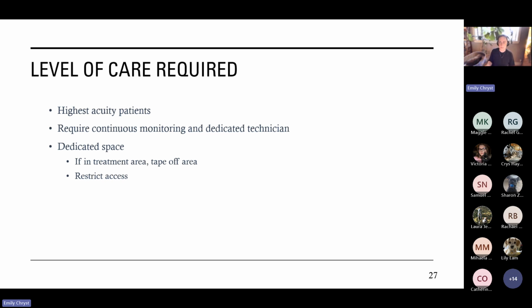The big difference is the stakes. So these patients are completely dependent on us for ventilation. That's why it's colloquially termed life support. So small changes matter more and big changes happen faster. So instead of thinking this is something totally different and this is terrifying, think this is what I already know, just applied more consistently and more vigilantly. So you're going to be watching trends really closely, but I want you to trust what you're seeing, and I want you to act early on these patients, not just assume that that little change you saw is fine. Like really intervene early, talk to your doctors a lot, especially as you're familiarizing yourself with what these cases entail.